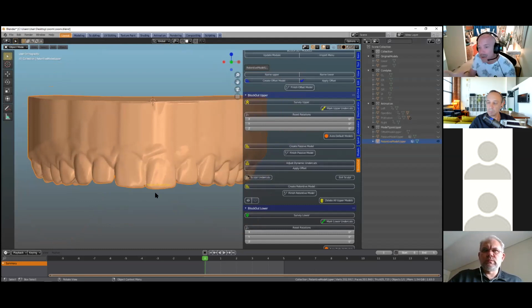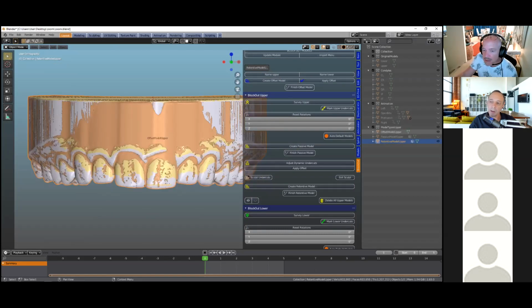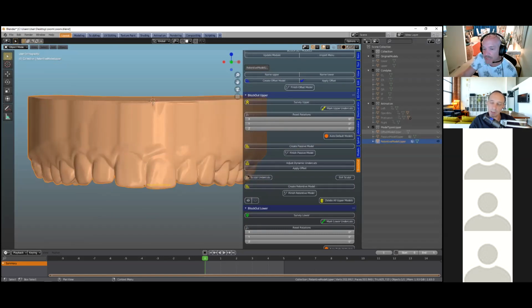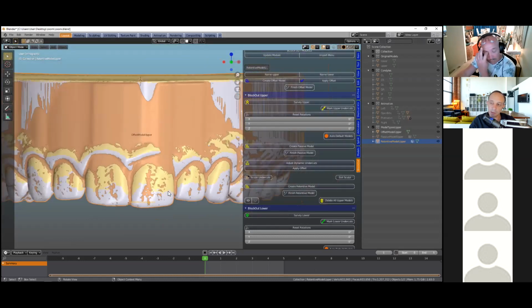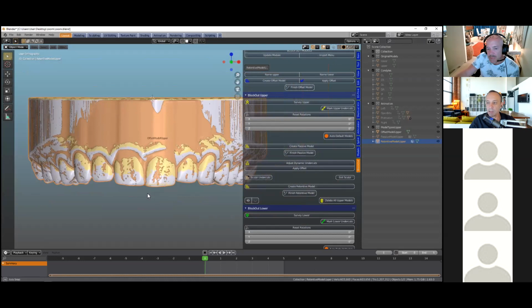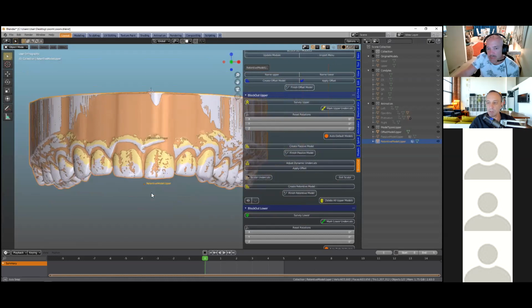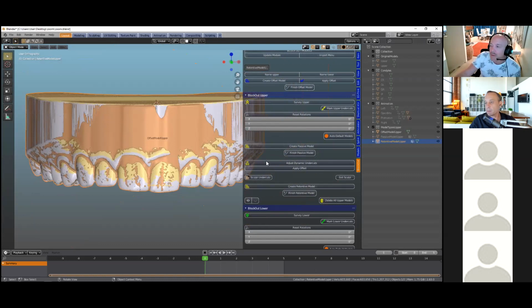If there's no undercuts, take the offset model. Michael, we're talking about sometimes some of these printable materials are slightly soft, or have a measure of elasticity. So if you're working with a very hard acrylic, then you might use the retentive model, but otherwise you could just use the offset model where nothing's been blocked out except the offset.